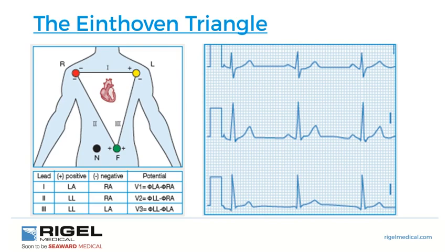And there's a graphical representation showing what a typical lead 1, lead 2 and lead 3 scenario should look like. Notice that on the graph you have a square wave. That square wave, that pulse, is generally the calibration pulse to check whether the printout or the displayed ECG is within 1 millivolt calibration.